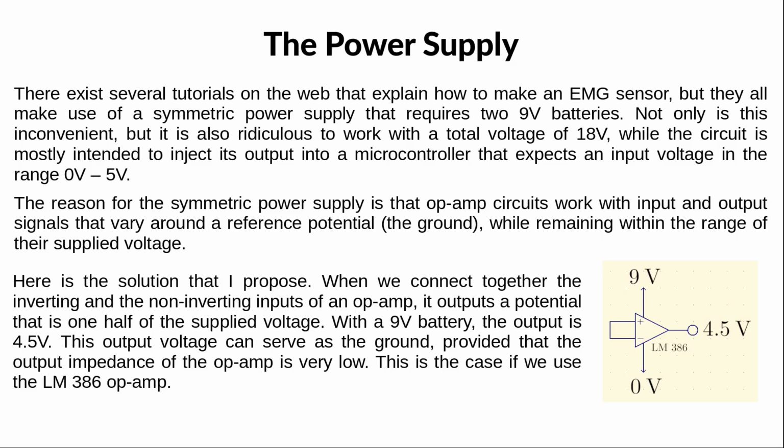When we connect together the inverting and the non-inverting inputs of an OpAmp, it outputs a signal that is 1/2 of the supplied voltage. This voltage can serve as a reference provided that the output of the OpAmp has a very low impedance, which is the case for the LM386 OpAmp. Thus, with a single 9-volt battery, the LM386 outputs a voltage of 4.5 volts, which can be reinterpreted as the ground, while the positive and negative terminals of the battery are reinterpreted as plus and minus 4.5 volts.